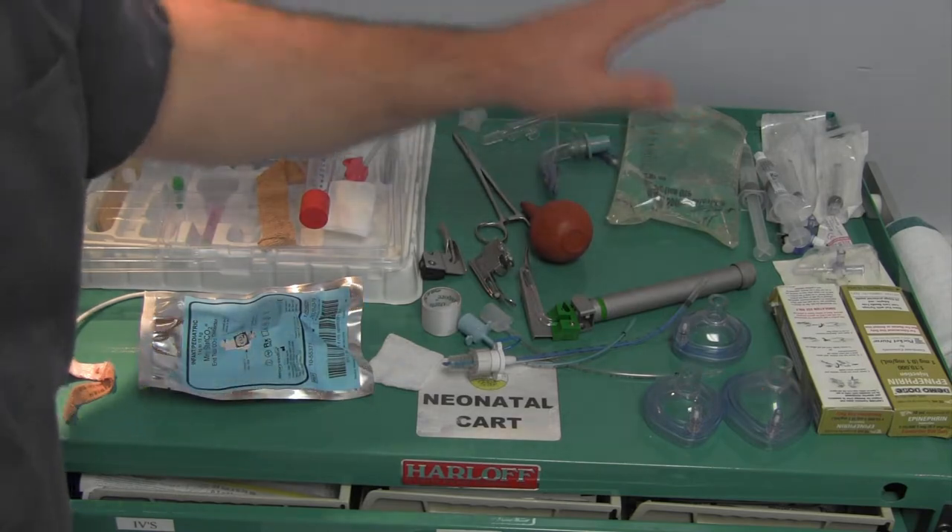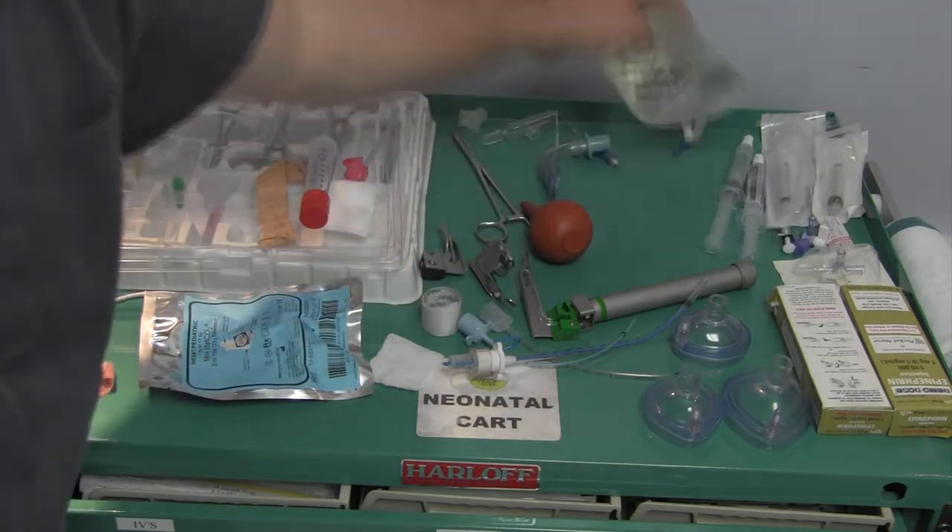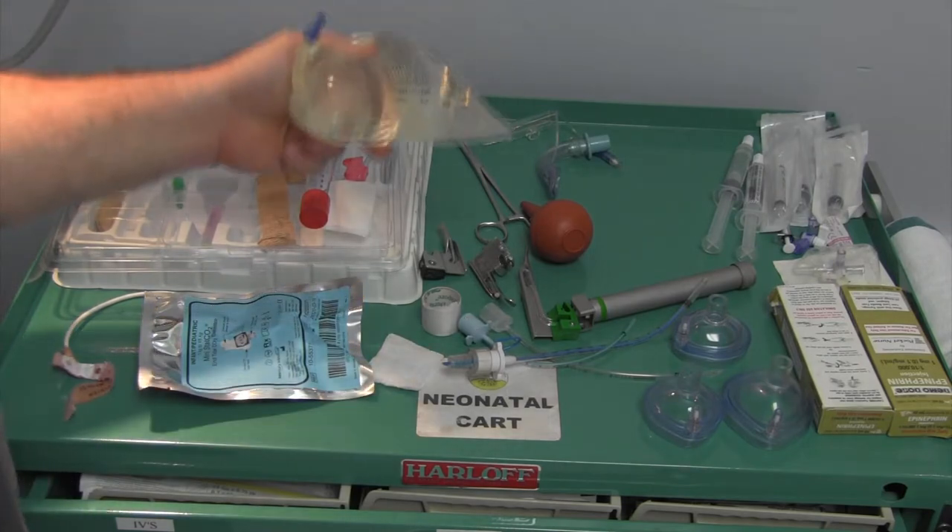We have some stopcocks and some 5ml syringes, some syringes with saline, and we also have a 500ml bag of normal saline.